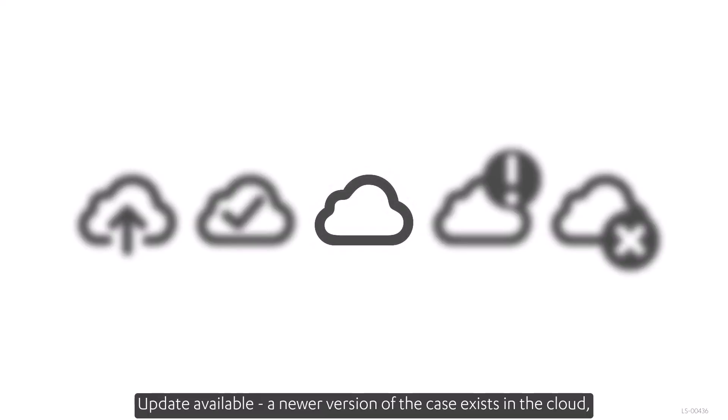Update available. A newer version of the case exists in the cloud. Make sure to synchronize the details so you're working on the most recent version.